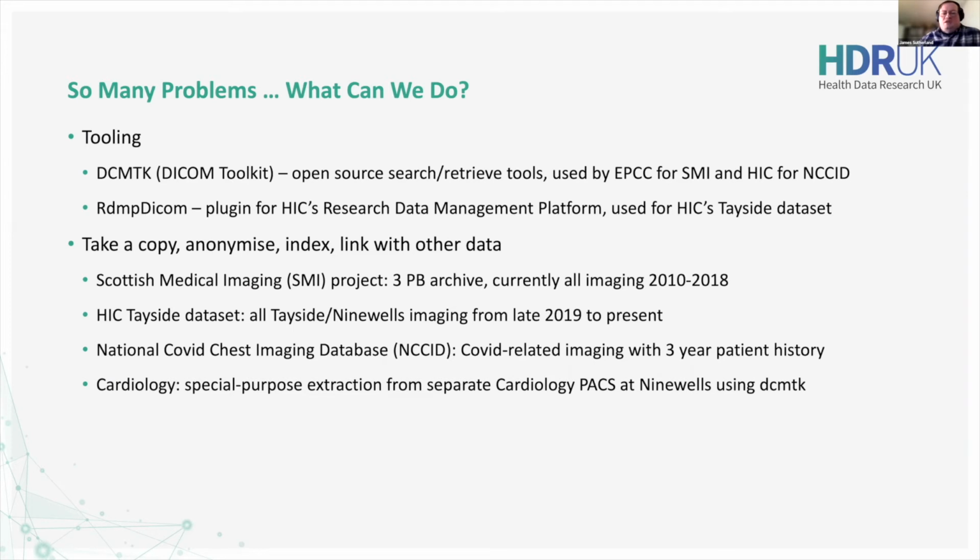Those are all examples from England, where they have quite a different challenge from Scotland, where Scotland has a single nationwide archive of all the images. England just doesn't. There isn't that common platform. Each NHS trust or hospital has its own isolated PACS and no direct connection between them.